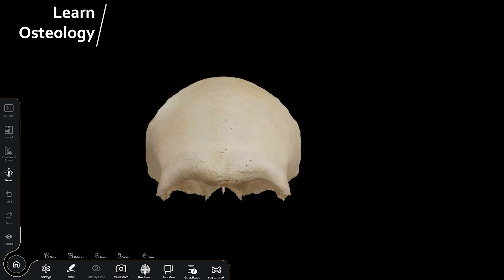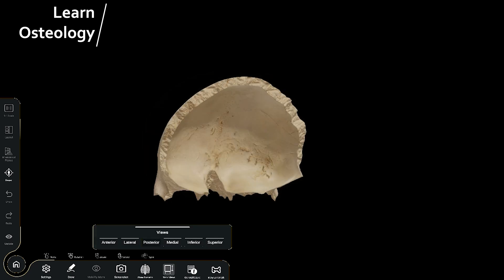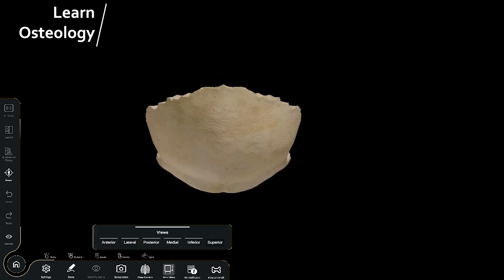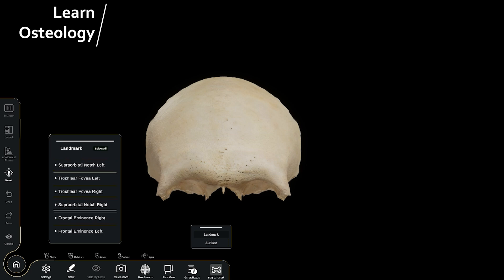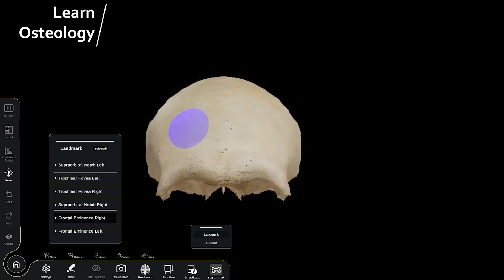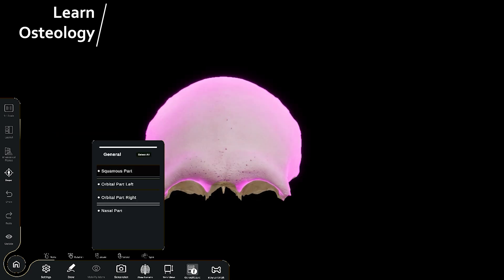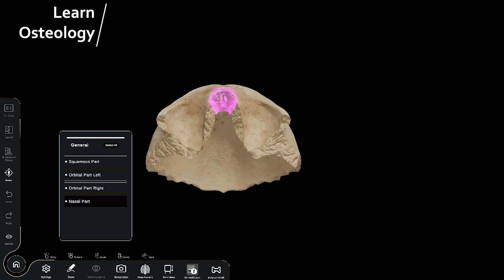Osteology. With this virtual human dissection table, you can examine each bone separately. Learn about their landmarks, ossification, and attachments to gain a comprehensive understanding of every bone in the human body.